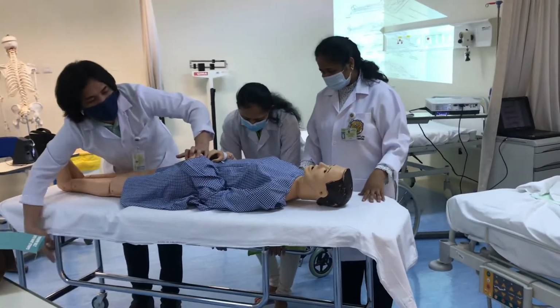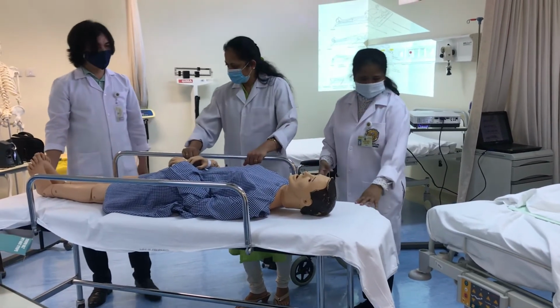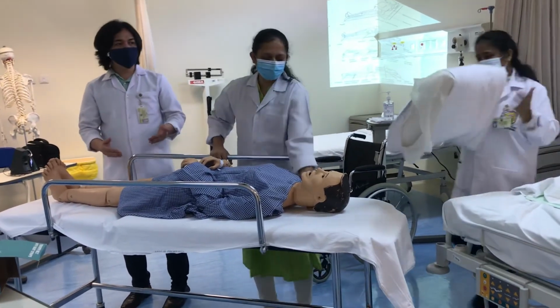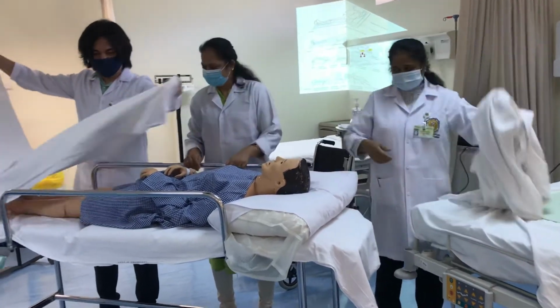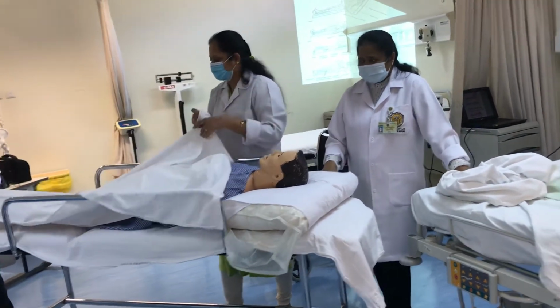And then make sure to put the side rails up. Actually, the head first. Okay? And then you cover your patient. And that ends the procedure.